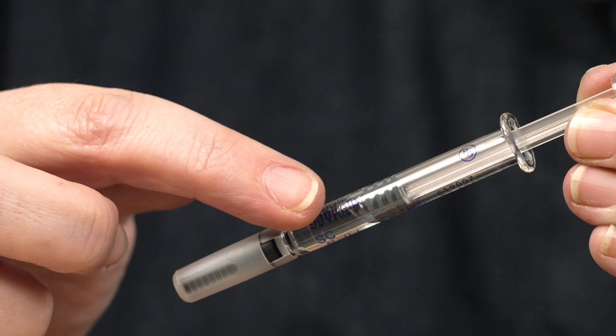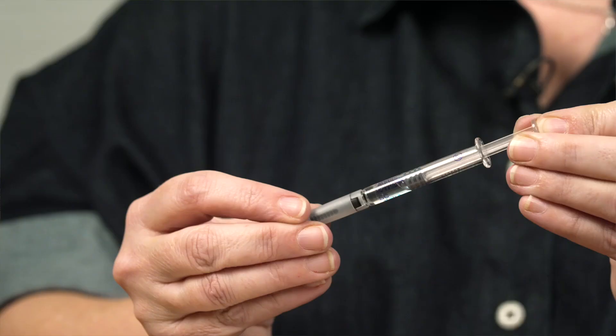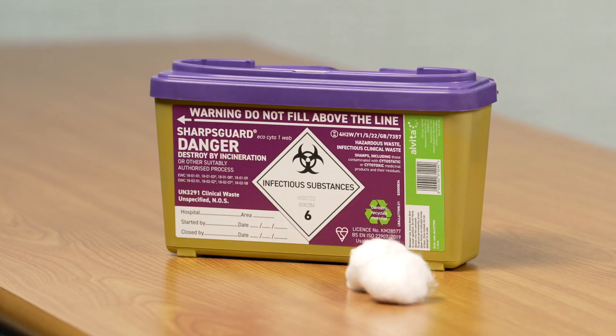If you notice any air bubbles in the pre-filled syringe, this is expected and removal of the air bubbles is not needed. If anything is wrong, dispose of the syringe safely into the sharps container and use another one.